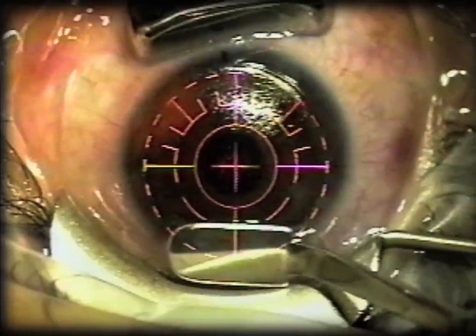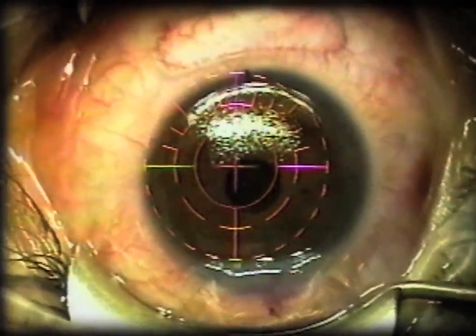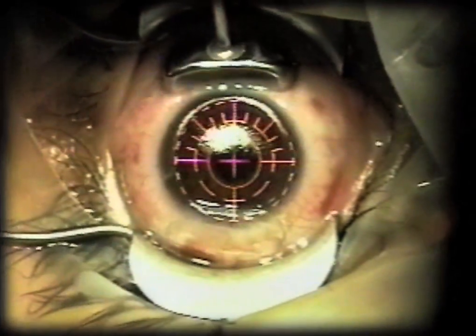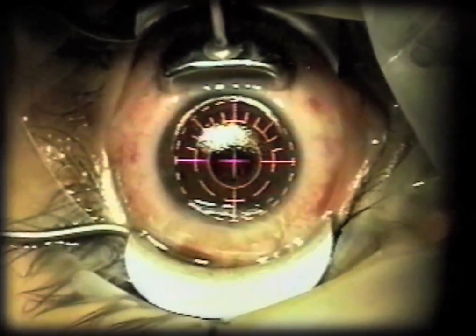Patients do not feel any discomfort from the suction stabilizer. You can see the impression that's made on the conjunctiva — that disappears in a matter of minutes. Occasionally you do get subconjunctival hemorrhages from the suction. If possible, it's good to have the suction stabilizer in a location where that would be covered by the lids, either above or below.